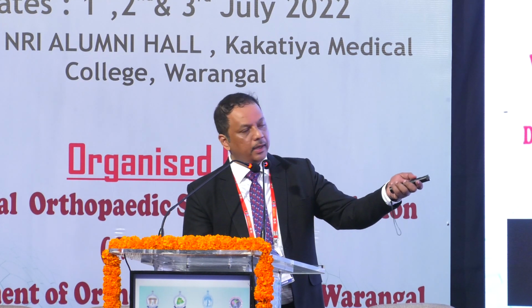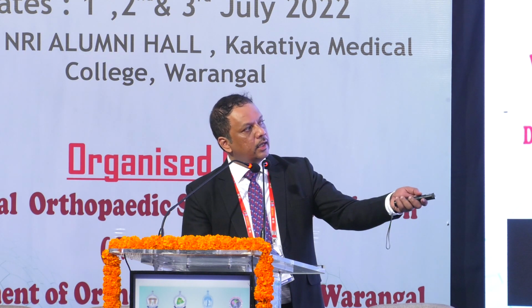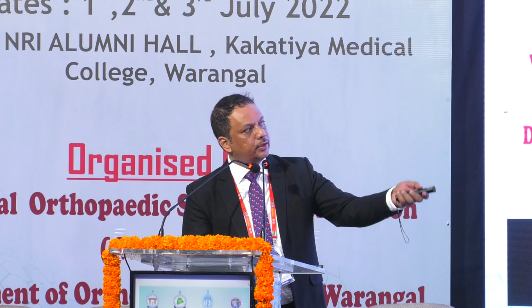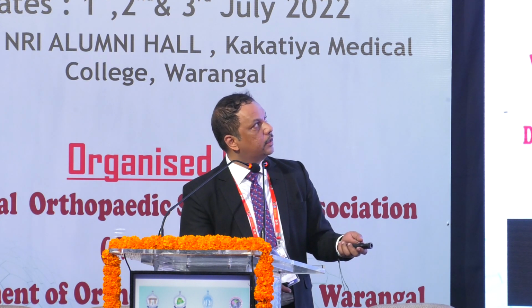Tips for plate osteosynthesis, general techniques. Again, restoration of volar tilt. You can use your plate to your advantage, right? You can use the plate in this manner, keep it at an angle, how much of volar tilt you want here, and once you press the plate down, you will get back your volar tilt. So take the advantage of the plate itself.